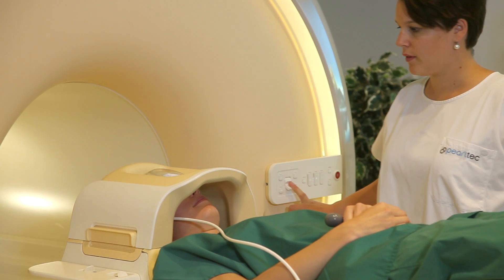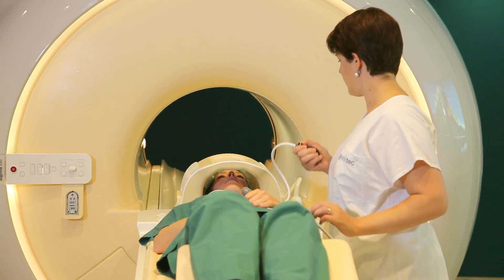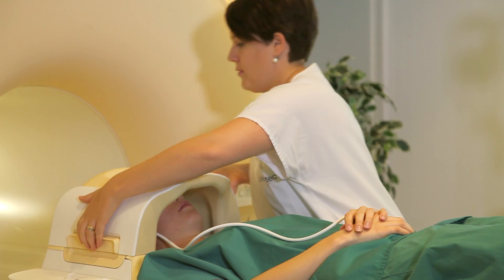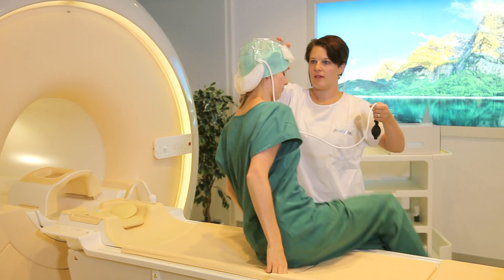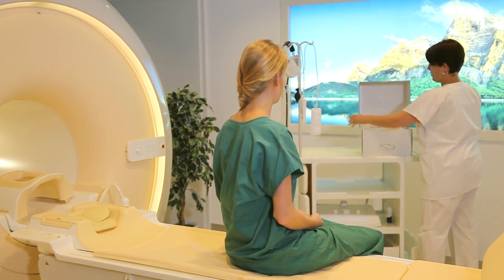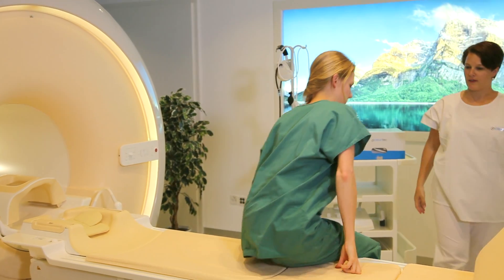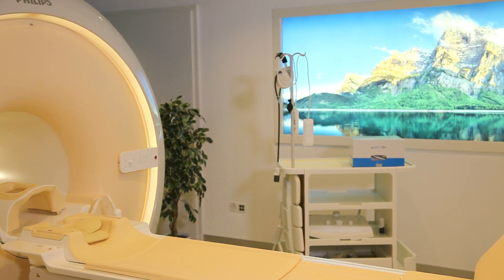When the examination is complete, simply release the pressure by pushing in on the air valve. Open the coil, let the patient sit up, and take off the crania. Then take off and dispose of the head cover. Wipe the crania down with any sanitizer and put it back in the box. There's nothing else needed and you are now ready to proceed with the next examination.